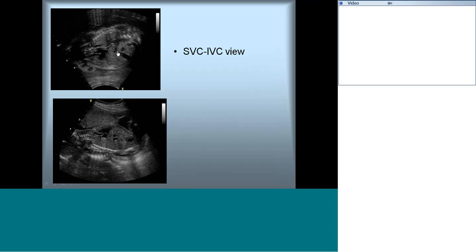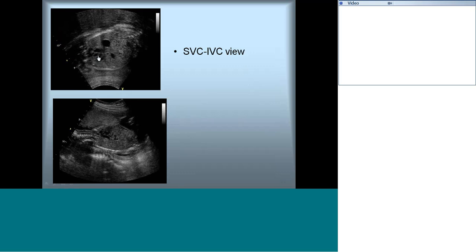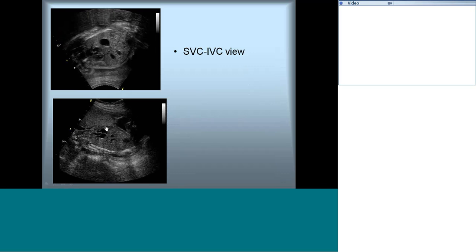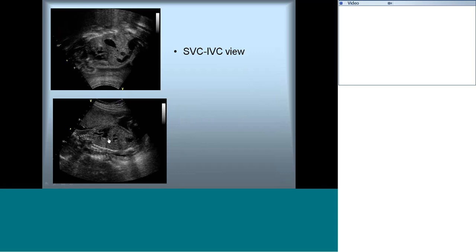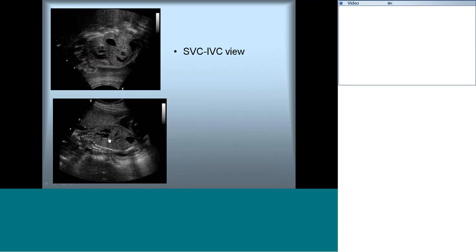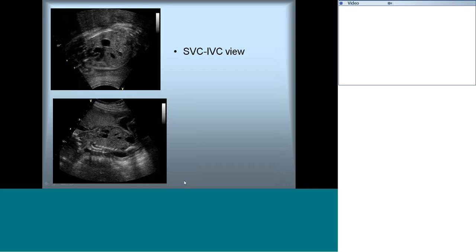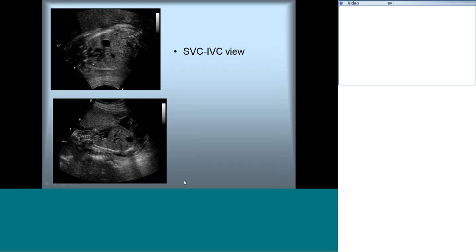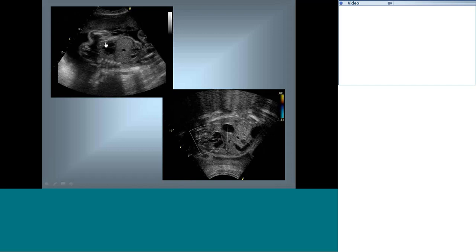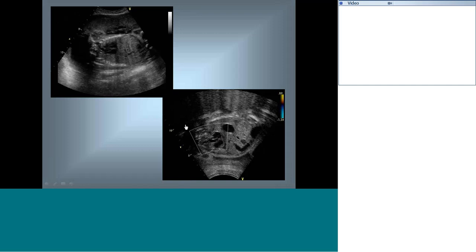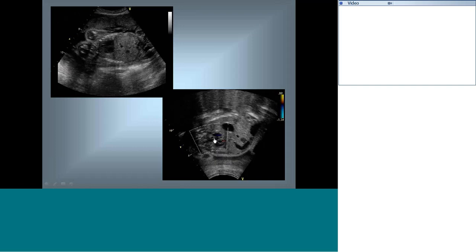The IVC is confirmed to be uninterrupted and the foramen ovale is unrestricted. A slightly modified view allows visualization of the SVC-IVC view, which is also important for the three-vessel view in fetal echo. Sweeping a little more will reveal the outflow tracts — the left ventricular and right ventricular outflow tracts — which can also be checked on color to ensure no ventricular septal defects and that the outflow tracts are patent.